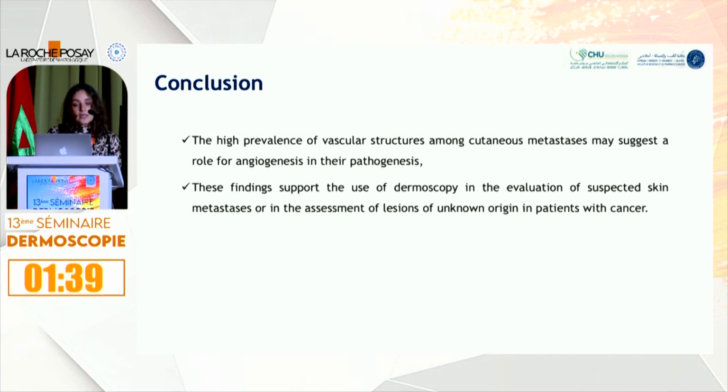As a conclusion, the high prevalence of vascular structures among cutaneous metastases may suggest a role of angiogenesis in their pathogenesis. These findings support the use of dermoscopy in the evaluation of suspected skin metastases or in the assessment of lesions of unknown origin in patients with cancer.